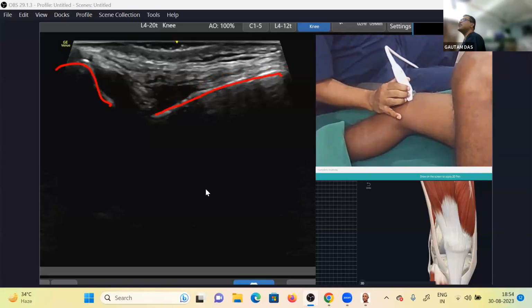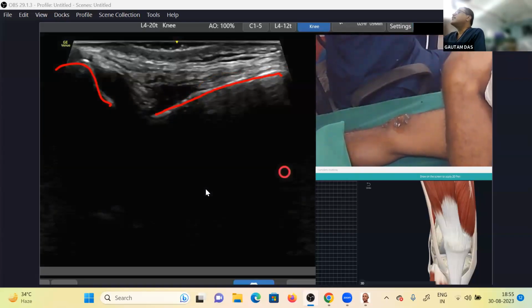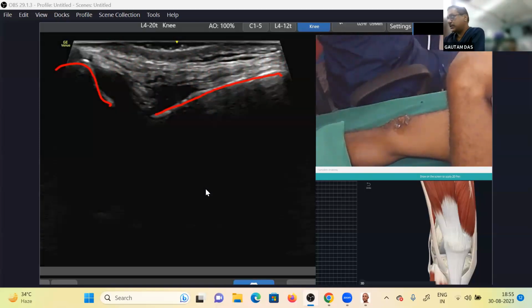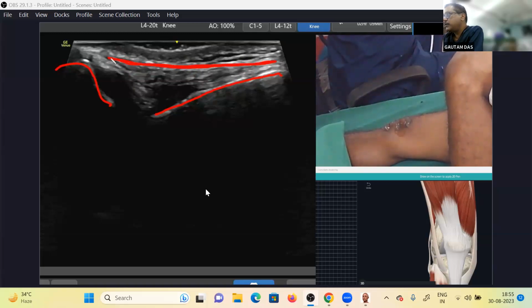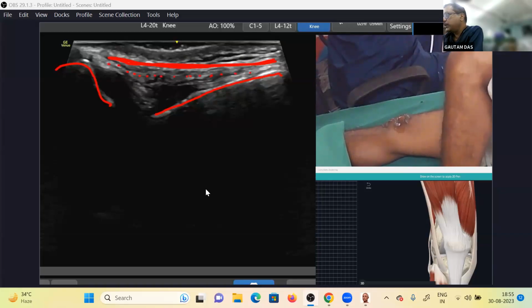Okay. So now here, try to understand two very distinct layers of the ligaments here, what I discussed there. One part is your superficial part. Can you appreciate that? And below that, there is another part. Can you appreciate? Both the ligaments are quite thick. Superficial part and deep. Okay, I'm drawing, and then again I'll be removing the drawing so that you can understand that. So, one part is this part, and another part is, I'm putting a dot. You remember ligaments are always normally sagging, lax, not tight like tendon. Can you appreciate the two layers?